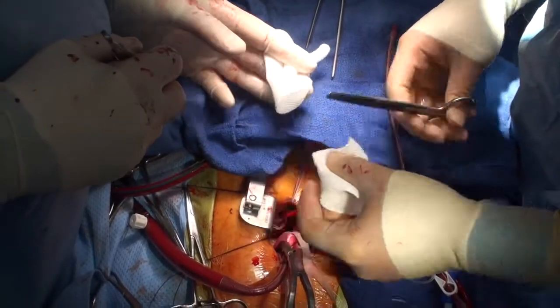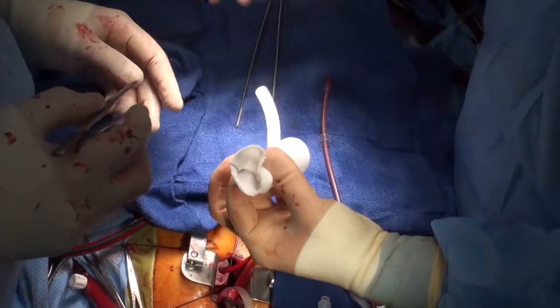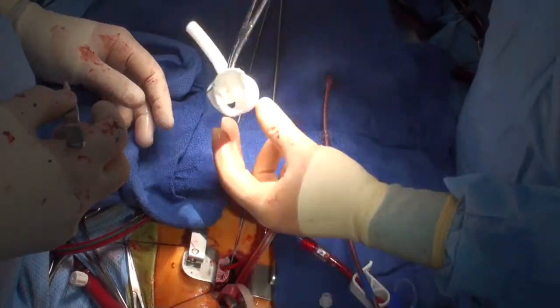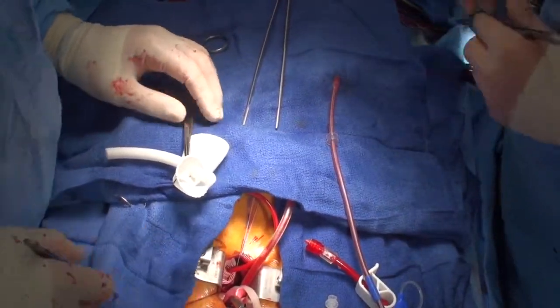Now we're going to size the distal graft. This is an aortic graft that has a sidearm, which we will use to replace the aortic cannula once we've done the distal graft, and then we'll clamp distal to this.